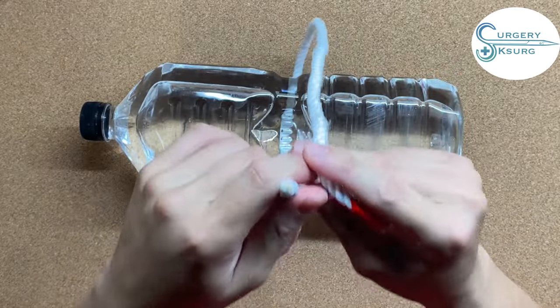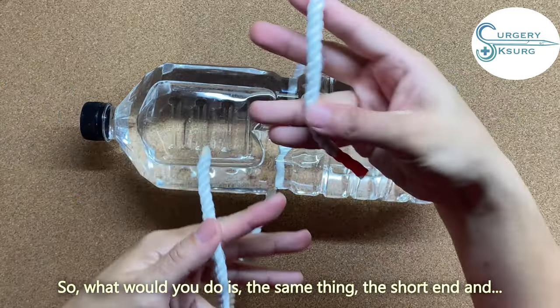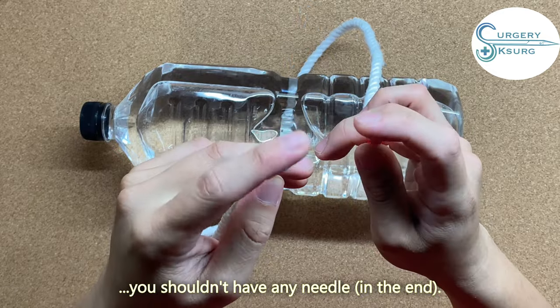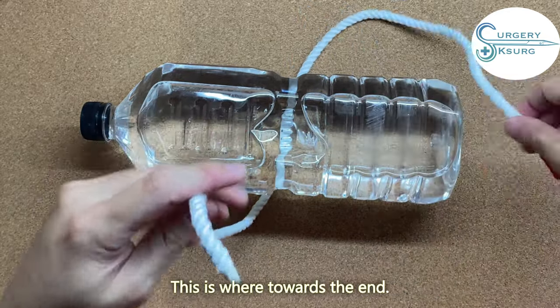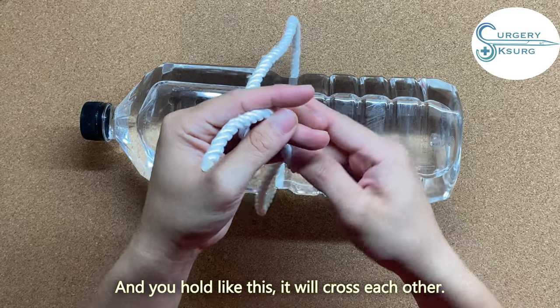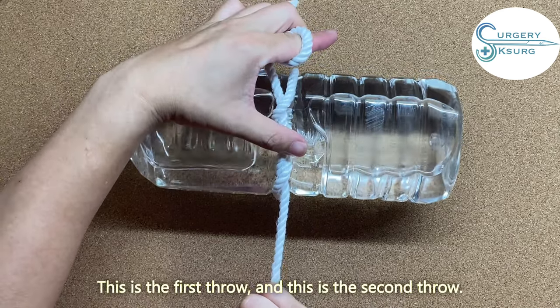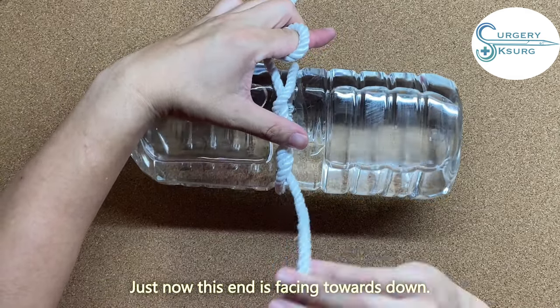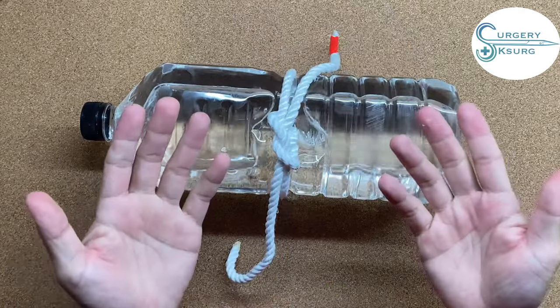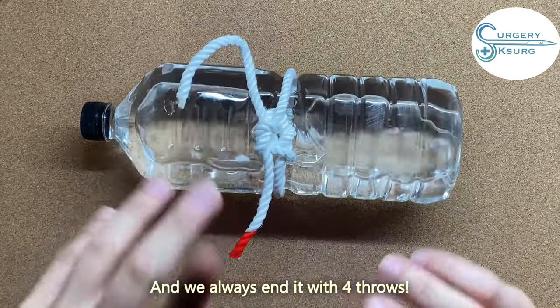There is also a variation called the two-hand surgeon's knot. You hook the same way with short end and long end, but with the two-hand surgeon's knot you shouldn't have any needle. This is used towards the end. This end is down, this one is out — you hold like this, close each other, and then pull. You can see the first and second throw, because just now it was facing down, now we go up. That's a two-hand surgeon's knot. Always end it with four throws — four throws is better than three.